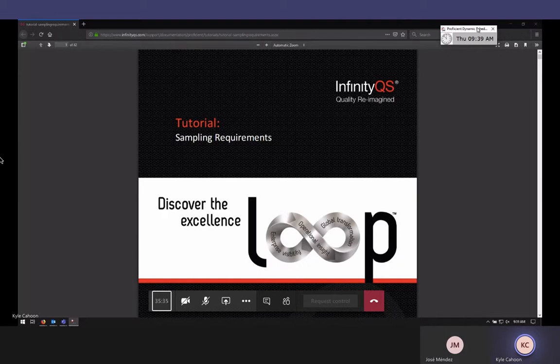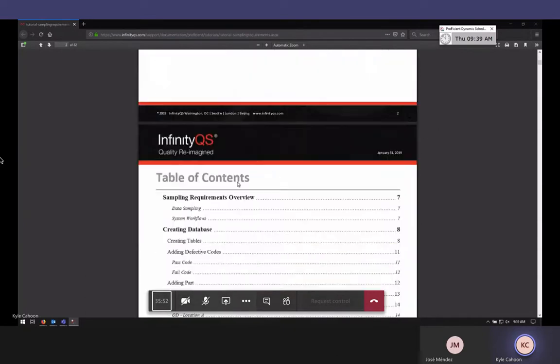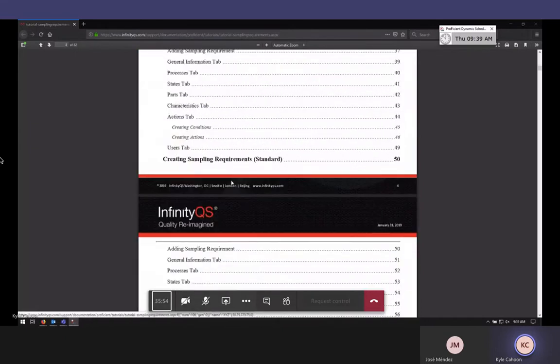And it can do a lot of things like force a recheck requirement. I'll show you how this works, and then we'll have you go through the tutorial, which is very similar to DMS.